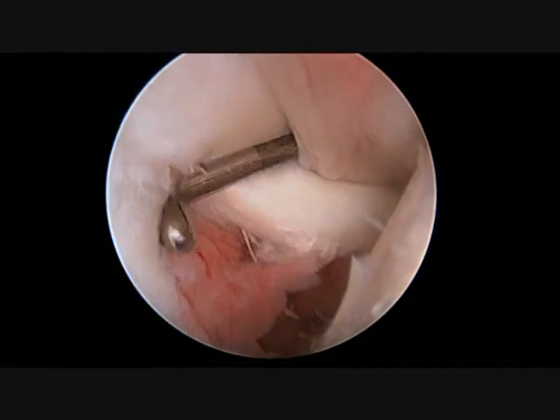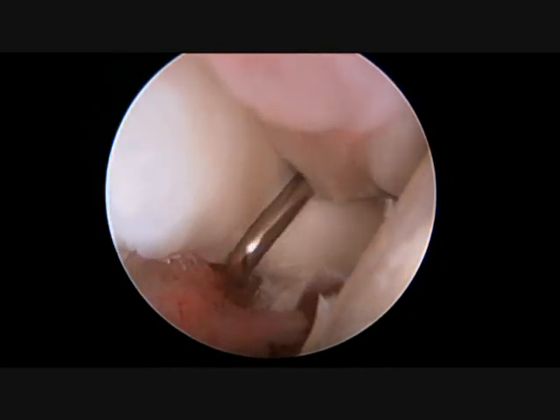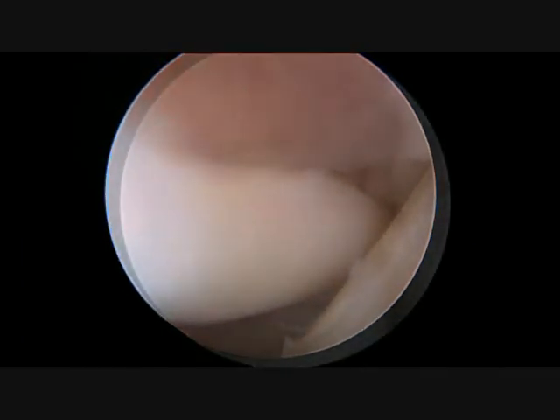In this view from the back of the shoulder, the biceps tendon can be seen stretching from the 11 o'clock to 2 o'clock position, with a tear involving a large portion of the biceps tendon. This is a classic appearance of a biceps tendonitis.